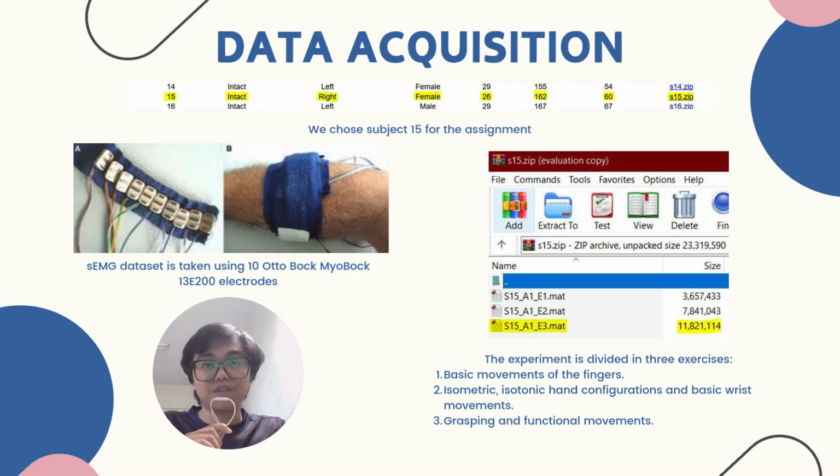An explanation of the signal that we have obtained: we chose subject number 15, a female, 26 years old, having the right hand as her dominant hand. The device used in this experiment is a 10 Otto Bock MyoBock electrodes, which is used to identify the sEMG signals, or the surface electromyogram dataset. Each subject performs three kinds of exercise. Number one is basic movement of the fingers, then we have isometric hand movement and also functional movement.